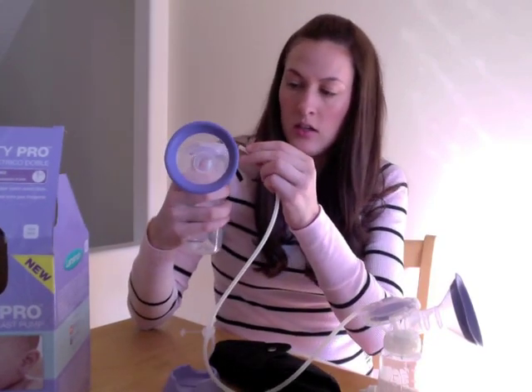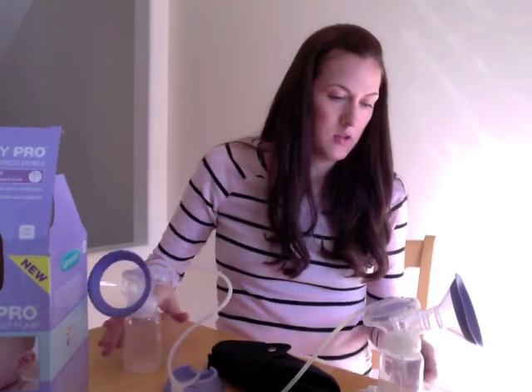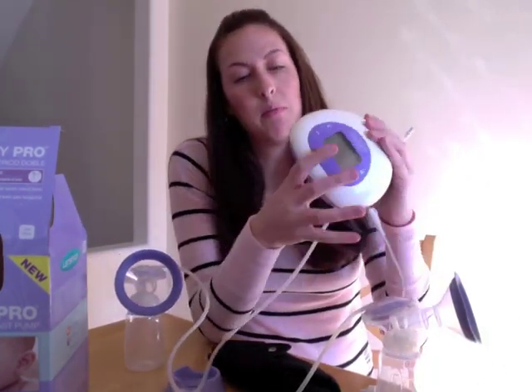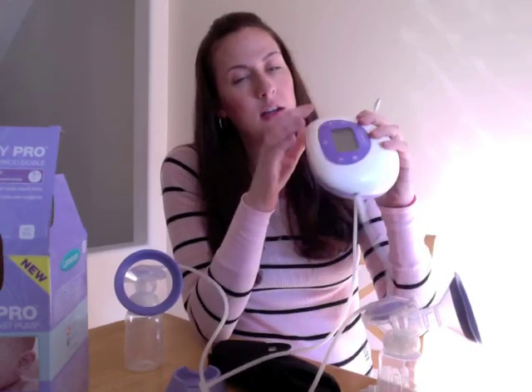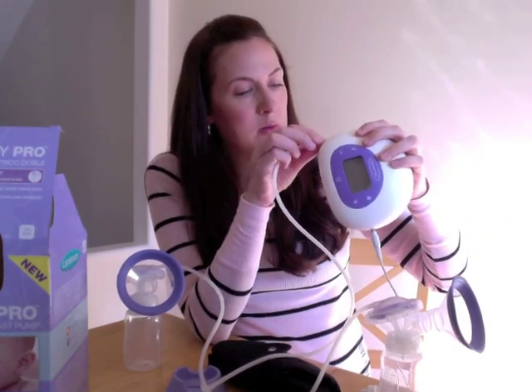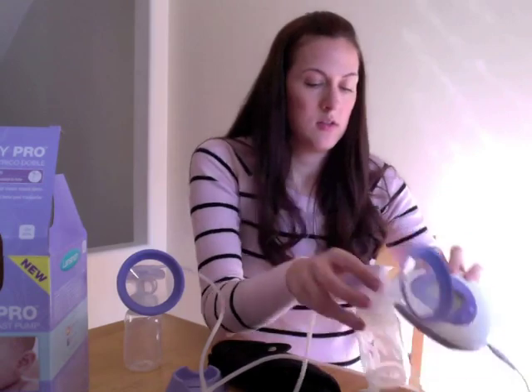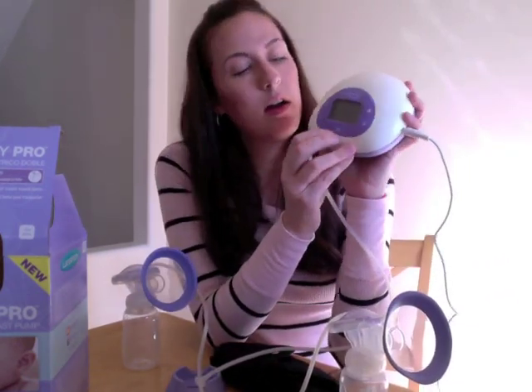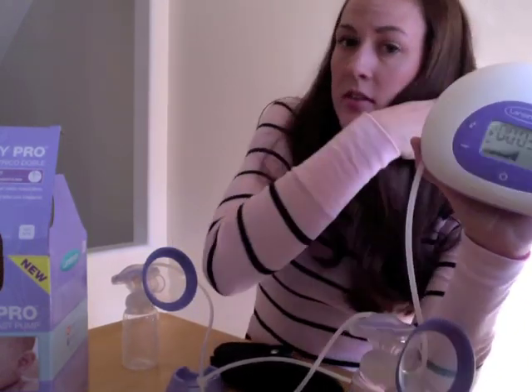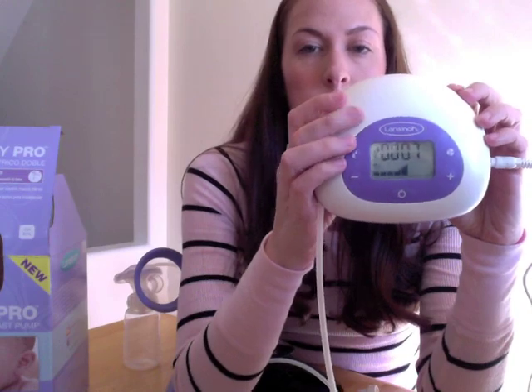You just connect the pieces onto each of the bottles, and here's the main part of the pump. You connect the tubing into this little white port right there. When you power it on, you just press this button here, and right away you can see that it starts timing how long you've been pumping, so there's a built-in timer.